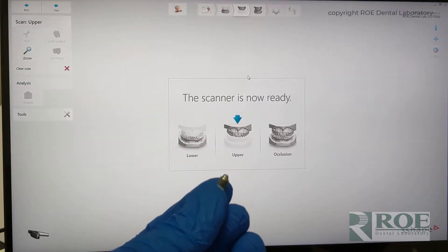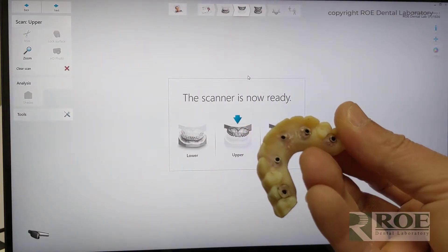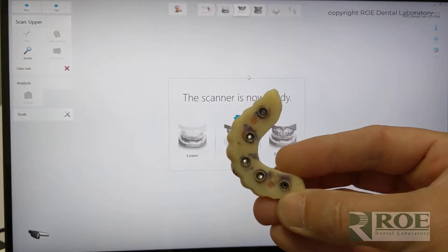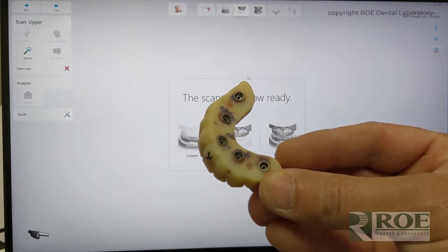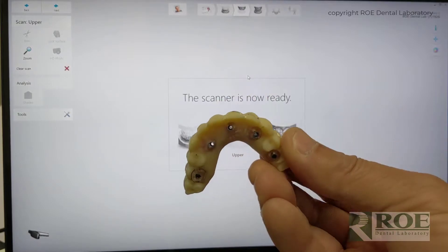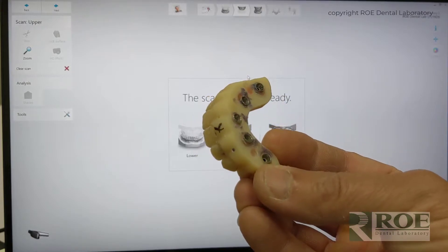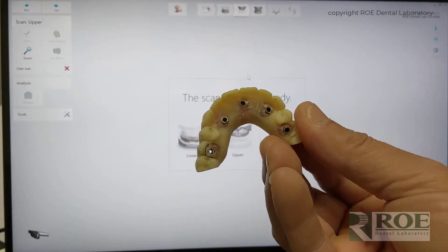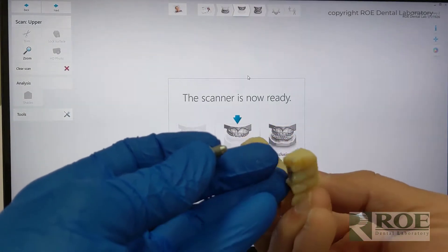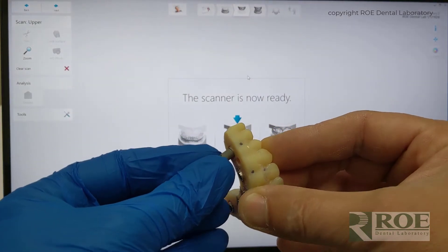The iJIG scan is the patient's long-term prosthetic. In this case, this is a rapid appliance — that's okay for demonstration purposes. But this would be an appliance that the patient has been wearing, either after surgery or really any appliance that's on multi-unit abutments that the patient has been wearing. We want to use it for records or maybe to duplicate, and to send to the laboratory. In order to do that, we scan this prosthetic 360 degrees with our iJIG scan analogs in place.